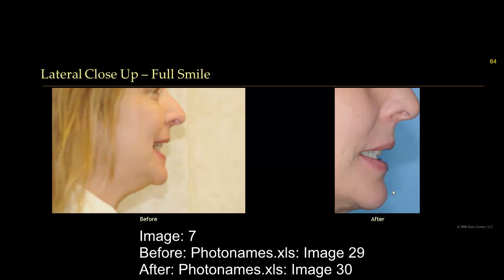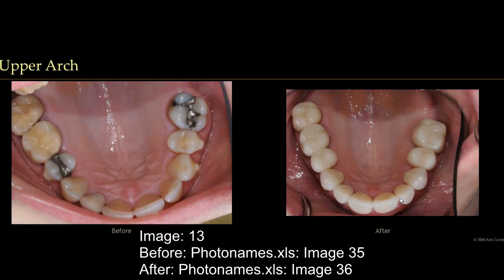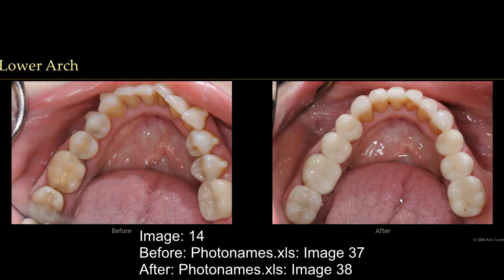So her midline is maintained. See the position of the upper anterior teeth, upper arch. They are aligned properly. The lower arch, you can see that's the last restoration I've been placing for her. That's 6 veneers. Again, the patient of course has a financial problem affording this case, and we did it partially. We're replacing the back teeth first, then we'll start doing the front teeth.